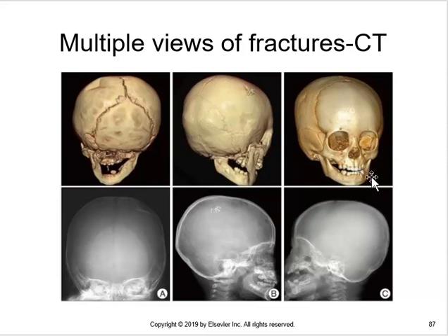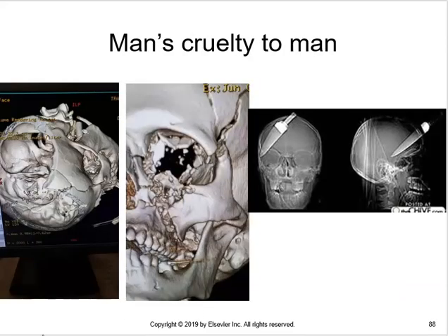The features are exaggerated. So that's how you know it's a child's skull. But you got a depressed fracture there. We've got other issues that we may have with the patient. We've had a situation here locally, actually, many years ago, where a patient actually got stabbed in the skull, and the patient was dead on arrival, but the knife was still inside of the skull like that.